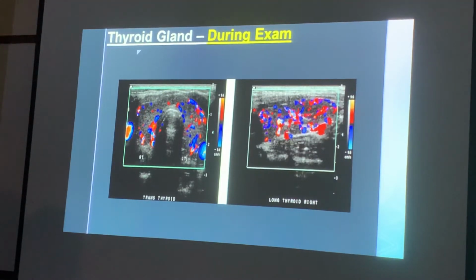Again, you see how big this person has that box on the right image, the long image. Make sure you make your box a little shorter so it's not taking up so much space, because you have a lot of empty space that you're not worried about on the posterior portion of that image.